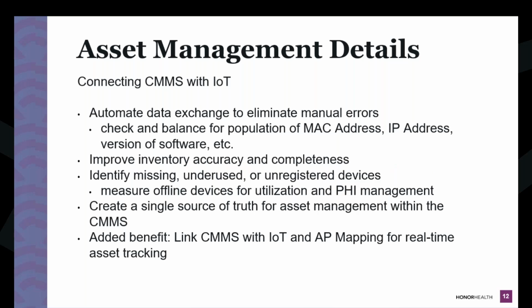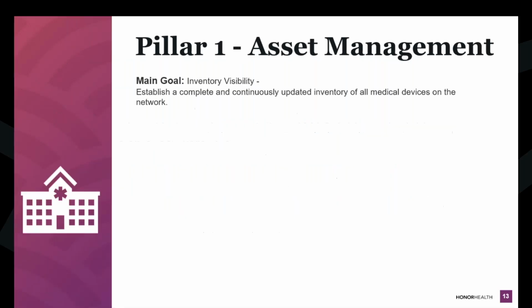We've seen infusion pumps in a ceiling in some hospitals. They're stashed away, right? People get creative with hiding their equipment. So know what equipment you have coming onto your network, but also know what hasn't been reporting on the network and hasn't talked to. And so it's a big part of asset management.